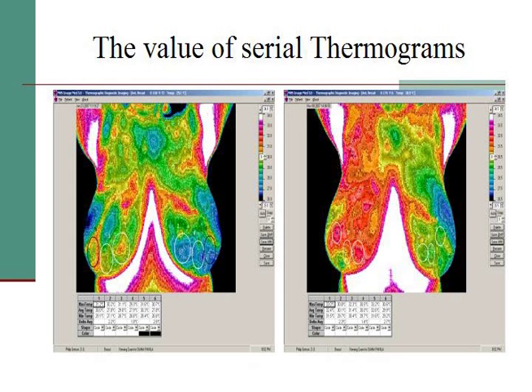And all that orange that you see on that right-hand side is the progression of the breast cancer, which unfortunately ultimately claimed her life. But the bottom line is that the first one was abnormal, and intervention should have started there. And the second one really showed a progression, by which time the intervention, whatever she chose to do, became much less valuable. So we're back to early intervention, early detection, early lifestyle change.